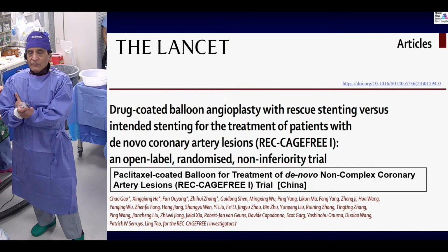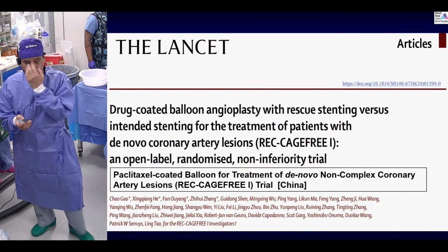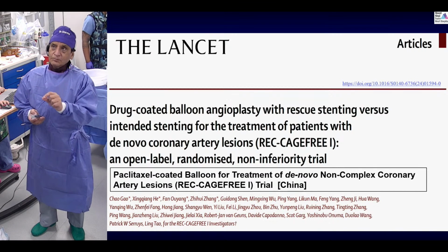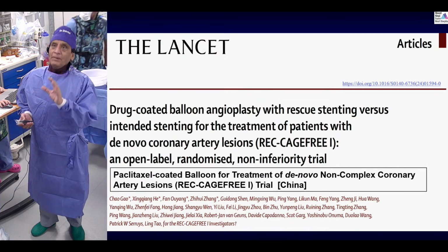In America, we are in 2 drug-coated balloon trials. We have done the solution ISR study, already completed. Now for the small vessel disease. So this was all comers, but simple lesions.